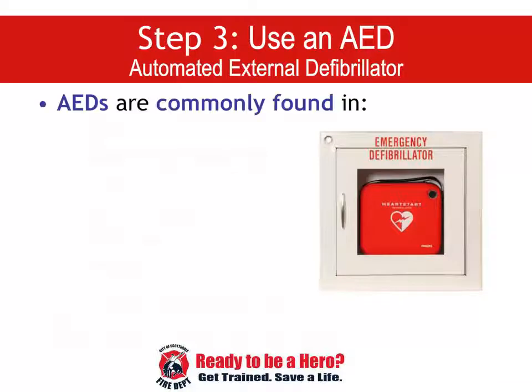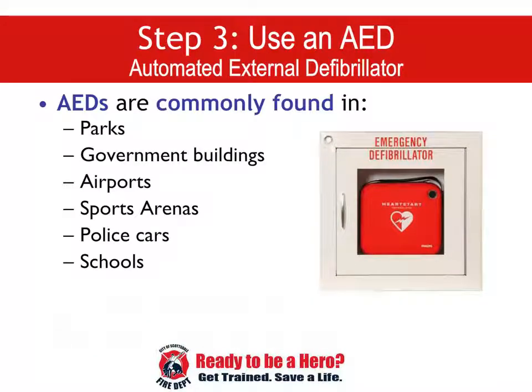AEDs are found in so many places, which really is a testament to how much they assist in cardiac events. Keep an eye out for AEDs wherever you go now. You may be surprised at where you find them. Most elementary schools have one AED, and junior high and high schools usually have 2.